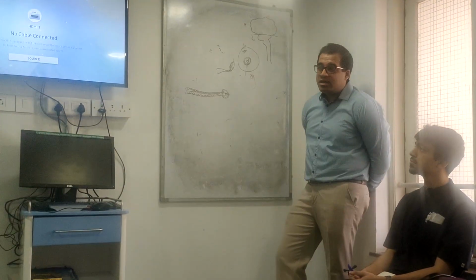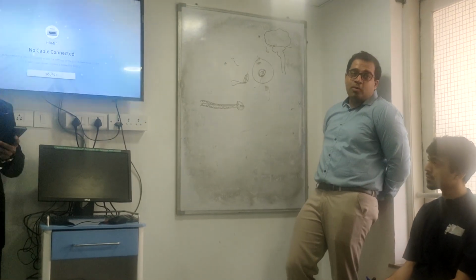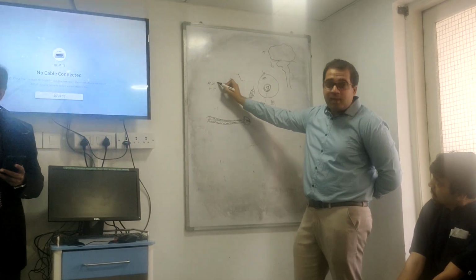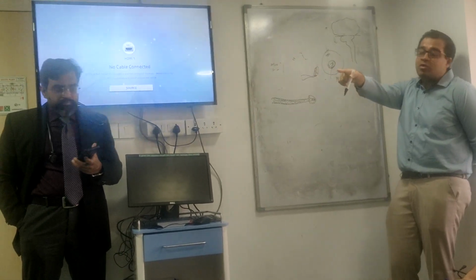However, if you're specifically thinking of a fungal infection, there is another bottle called Myco F Lytic. Okay, it's a red top. उसका full form है Myco F Lytic. F is for fungus and myco is for mycobacteria. You get even mycobacterial growths in blood cultures. I have to send this. अभी तुम ये bottle भेजोगे.